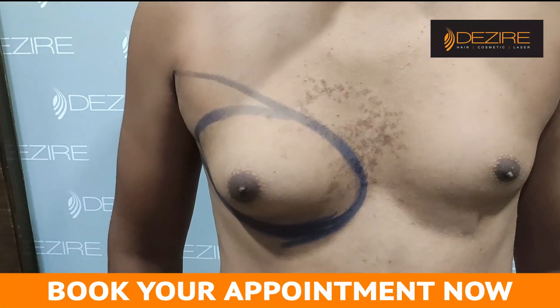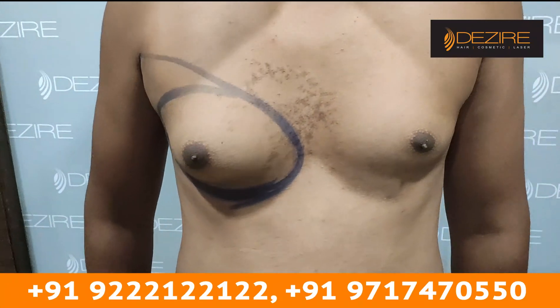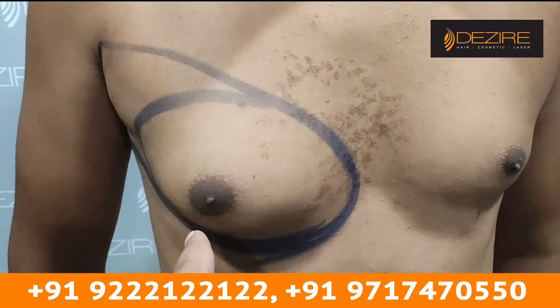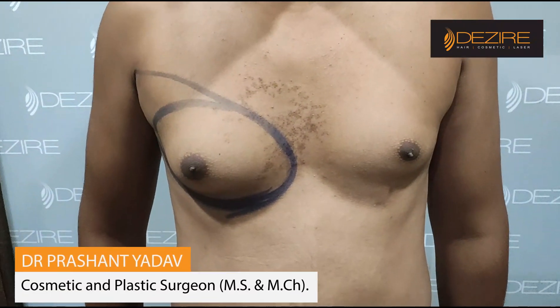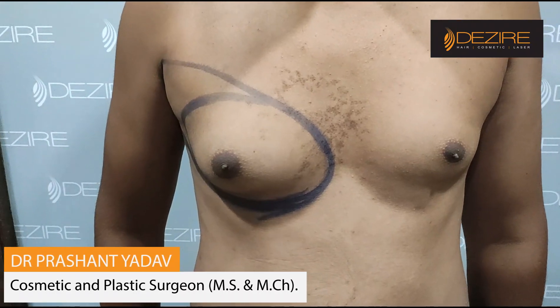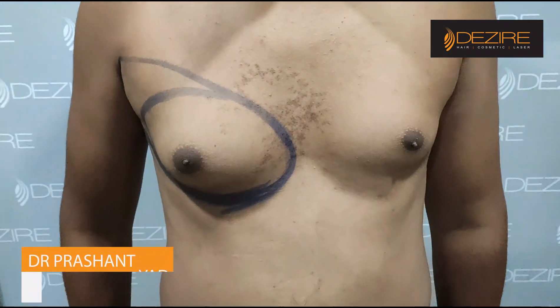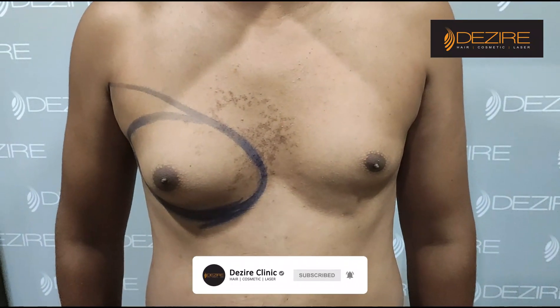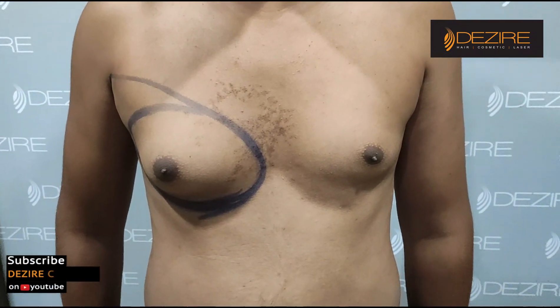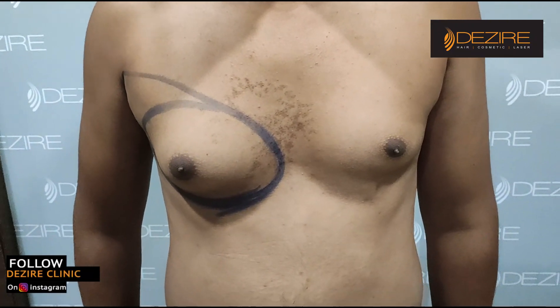This is the size of the right hand side as compared to the left hand side. We will puncture and remove the fat from all sides, and remove the gland as well. This is the procedure that we will start. This is one side — unilateral.